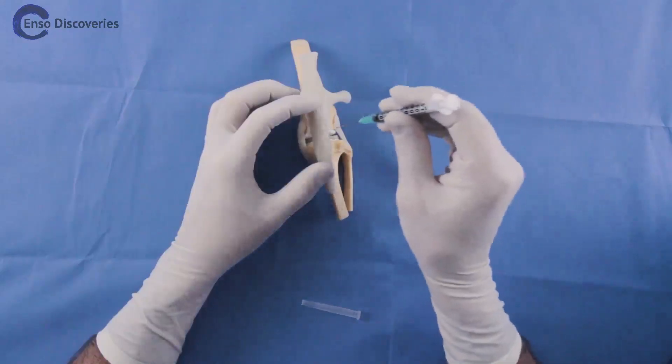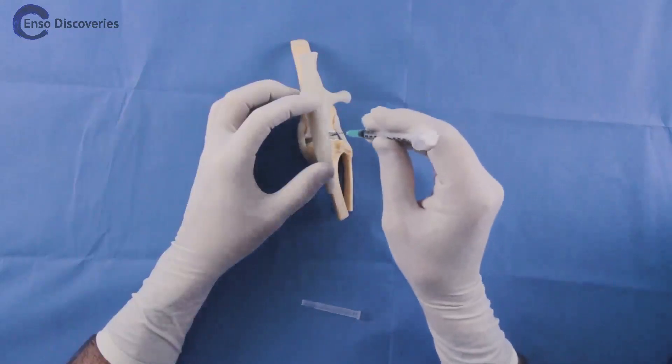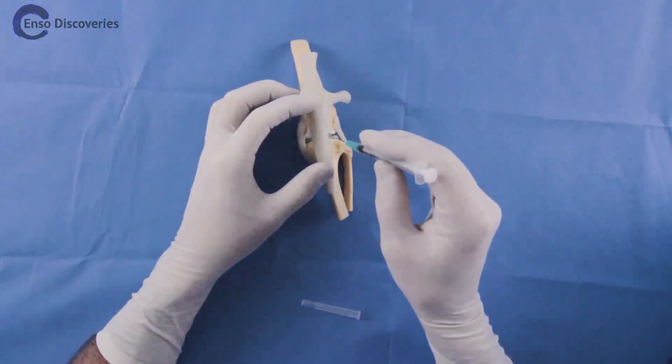The needle should be inserted perpendicular to the skin. Once through the skin, angle the needle approximately towards the midline.